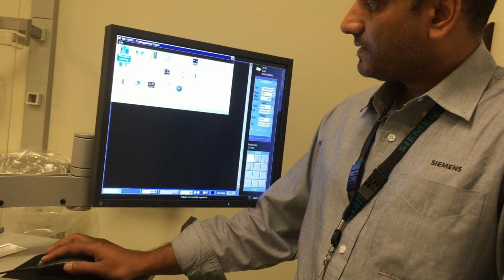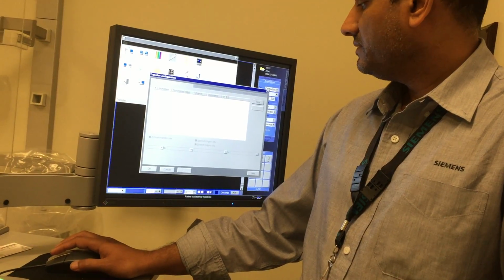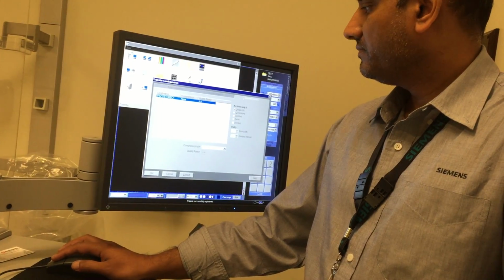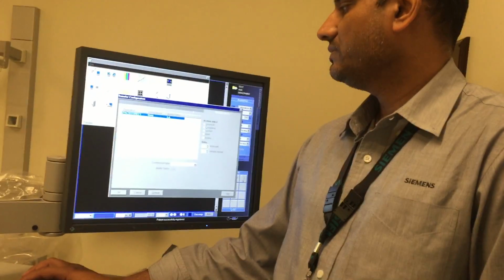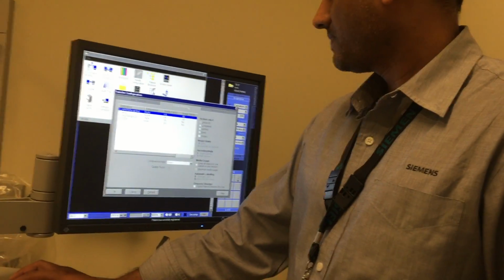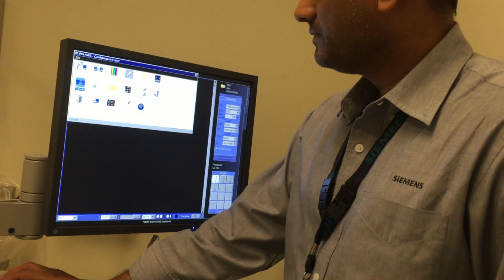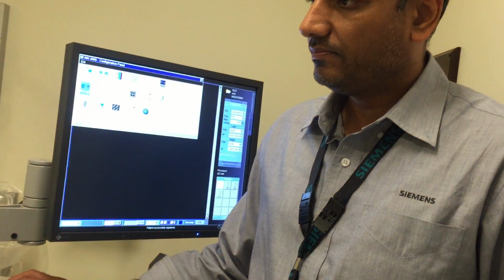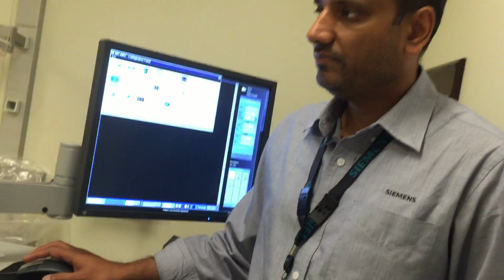The transfer is manual transfer, I guess. This one pretty much we usually go from service and set it up, and then if we have any issues, we come and make sure. This also is user access. So basically, when they do the clinical training, the FSR will be present or on standby. That's right. In the facility or just remotely? In the facility as well, or remotely as well. It depends. So we can be here on site.